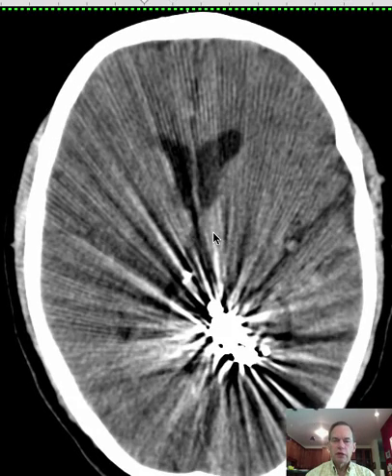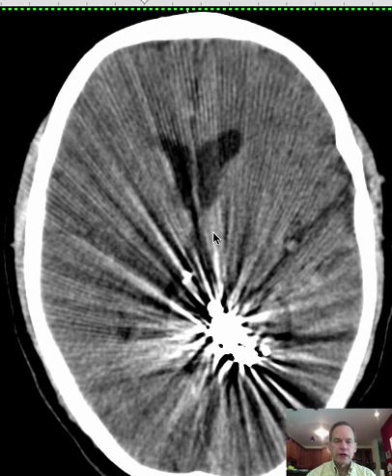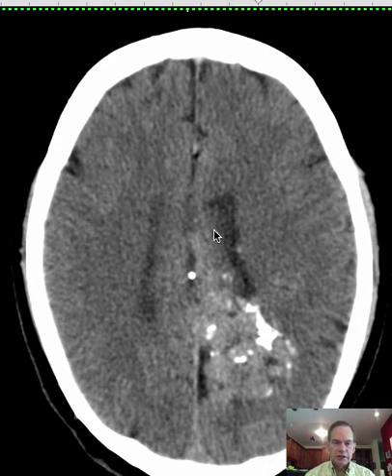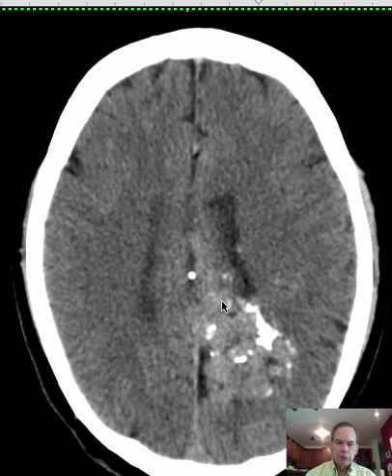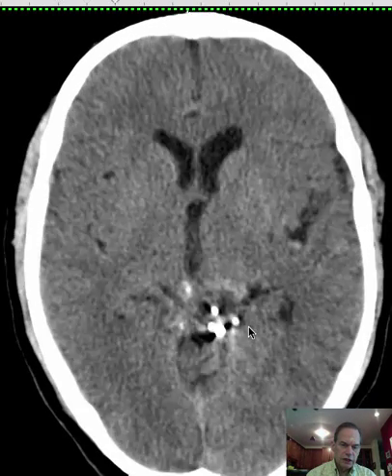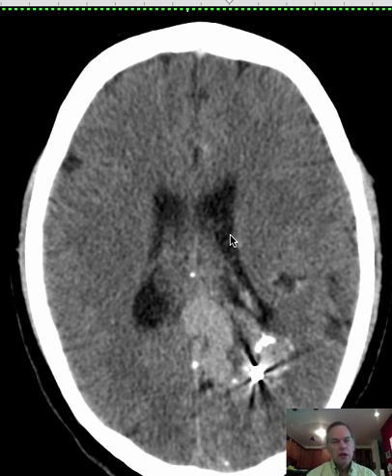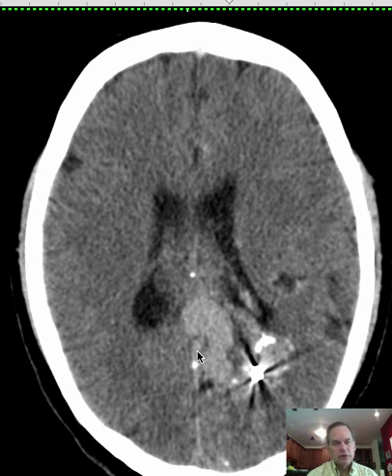We're going to start out with a description of the findings before we commit ourselves to an actual diagnosis. There are some interesting, uncommon findings here. There's an area of increased attenuation in the medial aspect of the left parietal lobe and portions of the occipital lobe. This also involves a portion of the left lateral ventricle posteriorly. And there's a relatively high attenuation area that crosses the midline, seeming to connect with the region of the straight sinus.